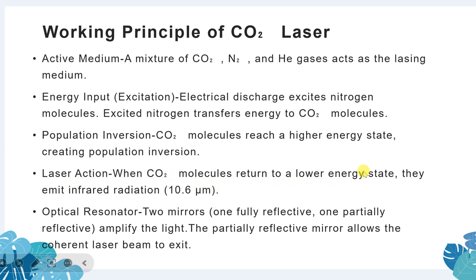When CO2 molecules return to a lower energy state, they emit infrared radiation. As I told previously, the CO2 laser used in medical applications has radiation of 10.6 μm, right? Then the optical resonators have two mirrors, one fully reflective and one partially reflective, which amplify the light, right? The partially reflective mirror only allows the coherent laser beam to exit.